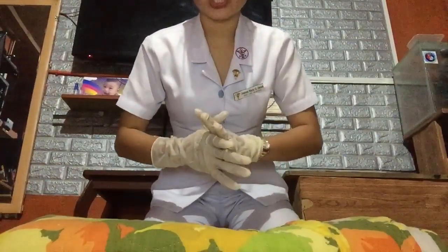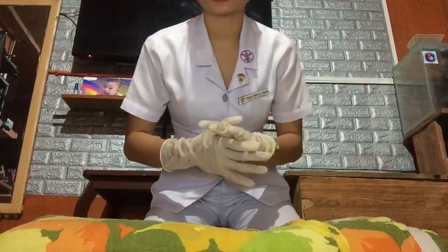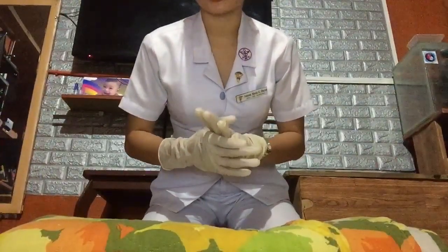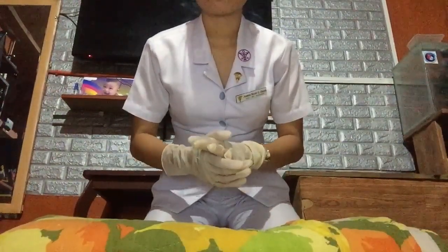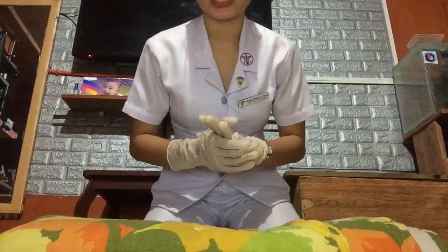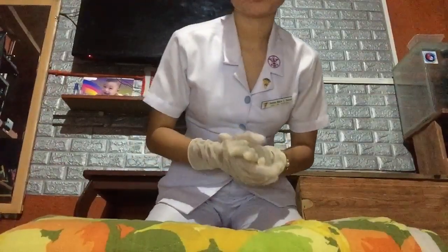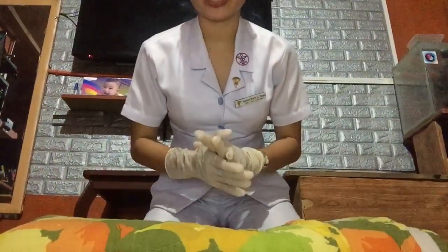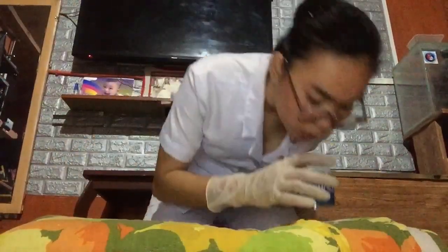After the chest compressions, immediately administer the two rescue breaths to the patient and use a bag mask or barrier device, covering the patient's mouth and nose with it. Head tilt and chin lift to open the patient's airway, and then deliver the rescue breaths. Each rescue breath should be given over one second, and there should be a visible chest rise for each. 1, 2.